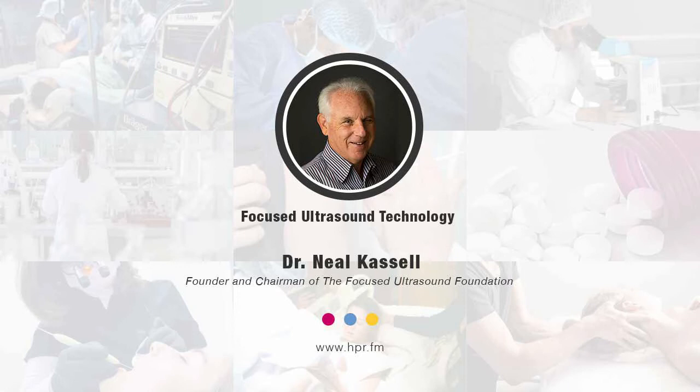So let's take cancer of the breast, for instance. Focused ultrasound can be used to destroy the tissue, destroy the tumor, as an alternative to surgery or radiation. Number one, it can be used to destroy the tissue. Number two, it can be used to deliver drugs in extremely high concentration precisely to the tumor and avoiding the systemic side effects. And number three, you can treat the tumor or a metastatic tumor and stimulate the body's immune response and enhance the effectiveness of the cancer immunotherapy drugs.